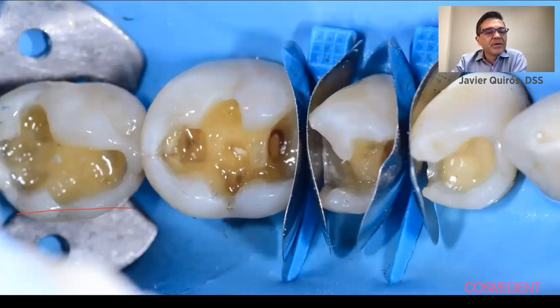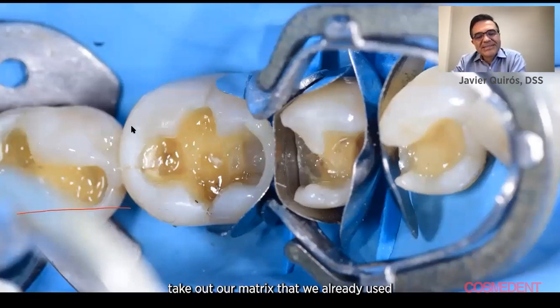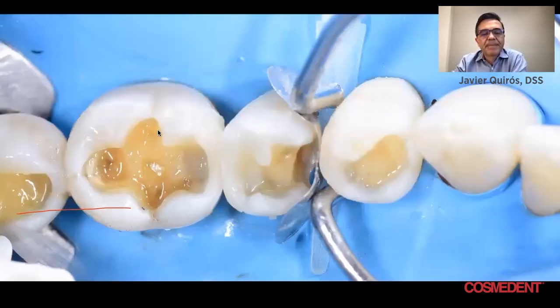And then we fill first one, cure it, take out the matrix that we already used, and then fill the other one. Take it out, fill the other one, and you have a great contact right there.